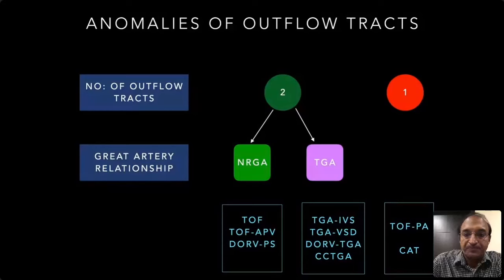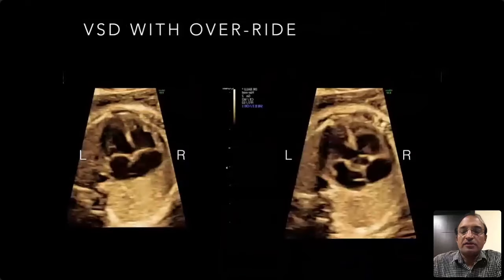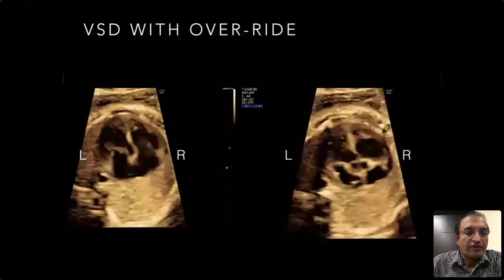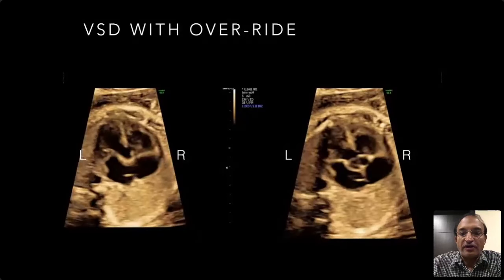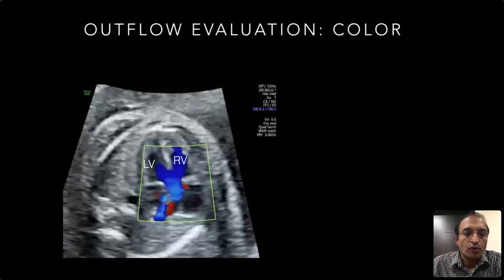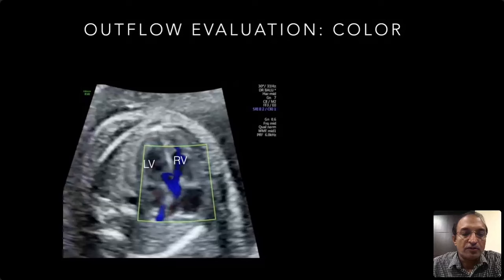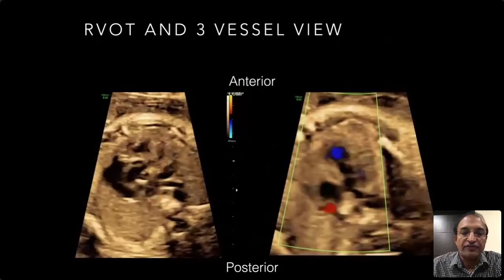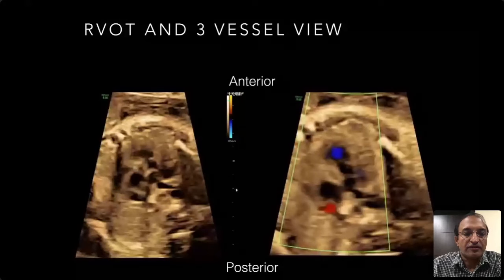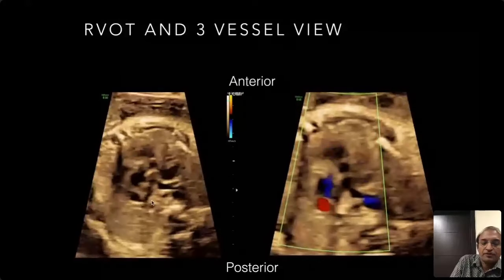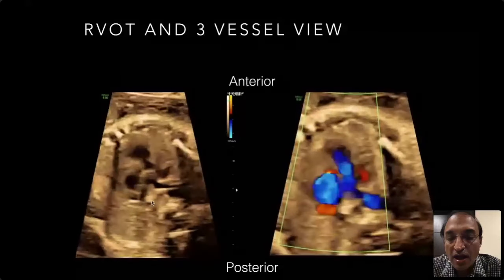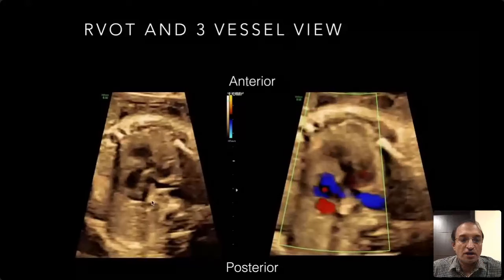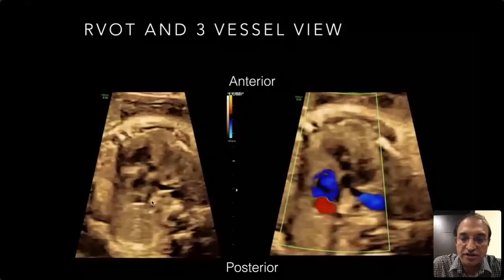Let us look at the first condition. You can see the left and right ventricles marked. As we move towards the outflow, a large ventricular septal defect is seen at the LVOT. With color flow, you see both ventricles ejecting into the same outflow. In the three vessel view, the pulmonary artery is anterior and nicely bifurcating. The PA is smaller than the aorta. So: balanced ventricles, large VSD, overriding aorta, and a small pulmonary artery — hence tetralogy of Fallot.